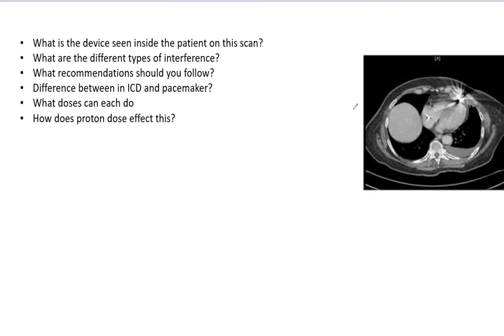Based on the questions, you can guess what I'm getting at. This is a pacemaker, but be absolutely sure you can tell what a pacemaker looks like and determine it on a CT scan. One thing that really helps is that in almost all cases, pacemakers are always on the left side and chemo ports are on the right side.